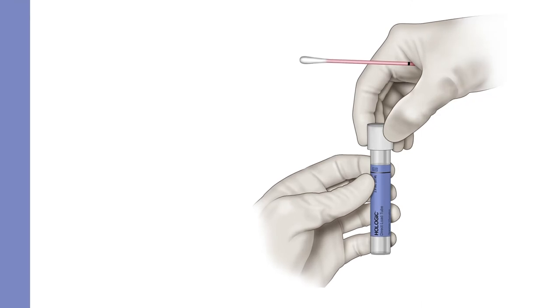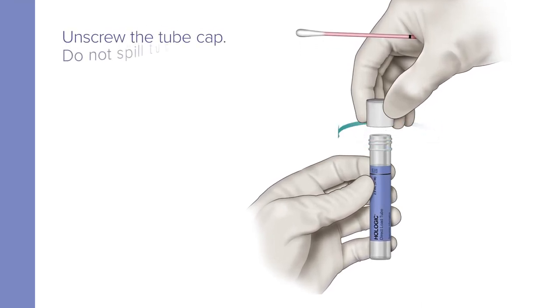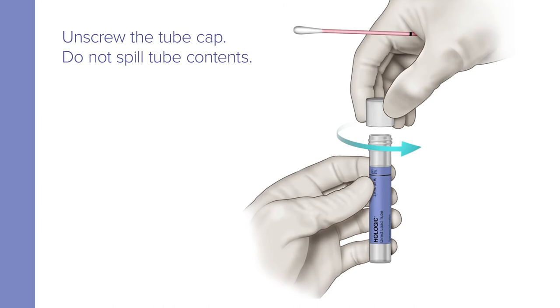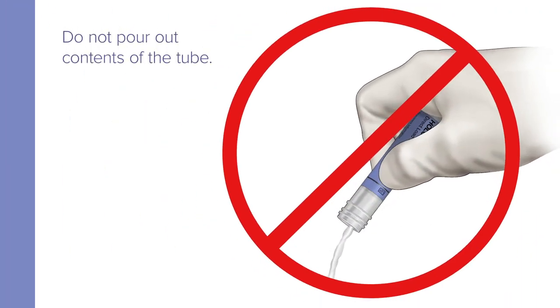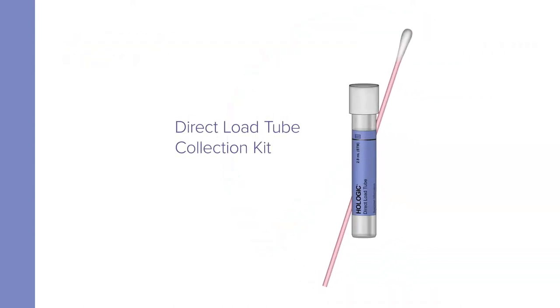While holding the swab in hand, unscrew the tube cap. Do not spill the tube's contents. Do not pour out the contents of the tube. If the contents are spilled, discard and replace with a new direct load tube collection kit.